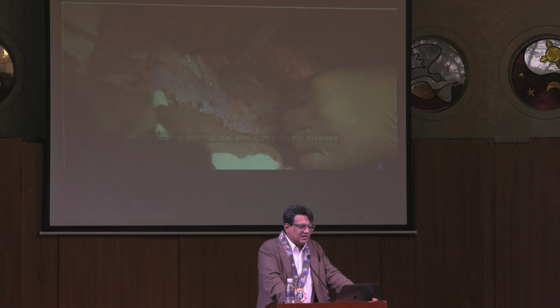This is the liver. We're using a special machine called a CUSA machine, which is an ultrasonic machine, to remove the capsule of the liver. And this is the diaphragm. The diaphragm is the division between the chest and abdomen, right? And now we're joining the intestine or bowel back together again. It can be done through stapling devices or through hands-on techniques. You can see after the surgery, it's very clean. There's no more cancer left behind.